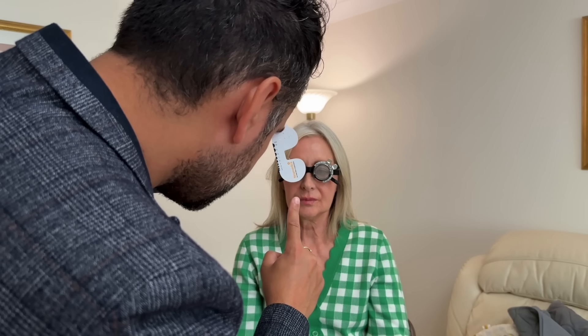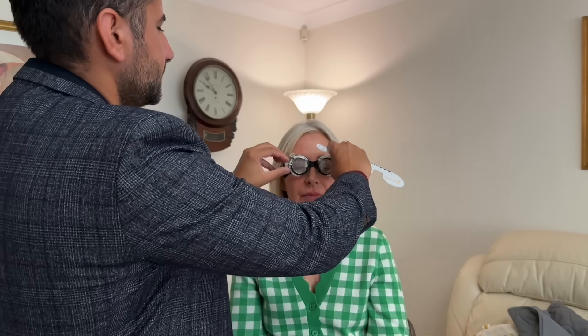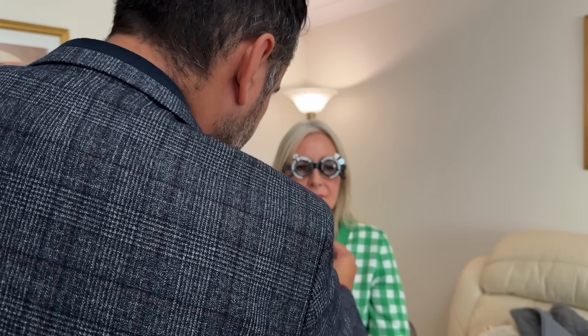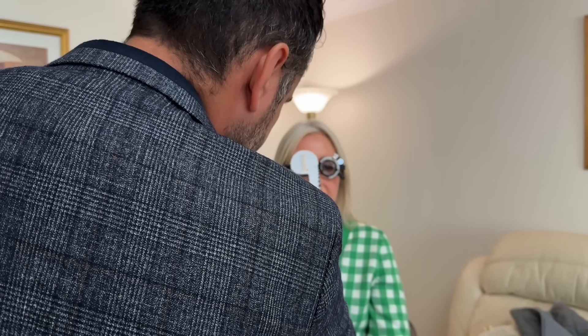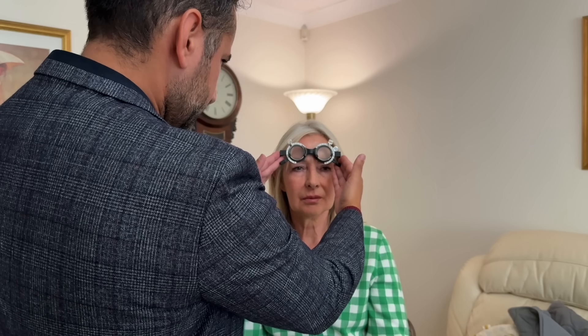Just looking at the tip of my finger. Keep looking at the letter T on the third row there. Just looking at the smallest row you can see — if I lift these up, is that a little bit more blurry? Yes. Does that make a difference? Yes — a bit sharper? Yes.